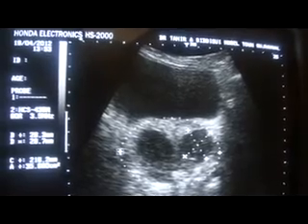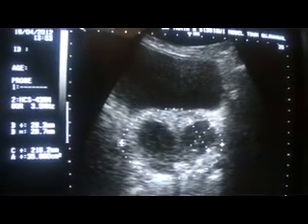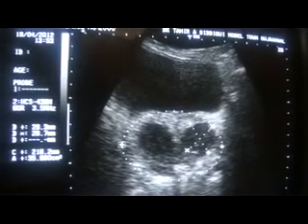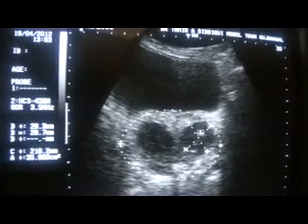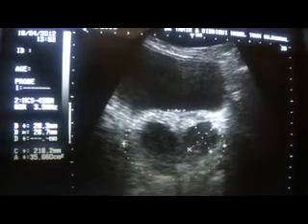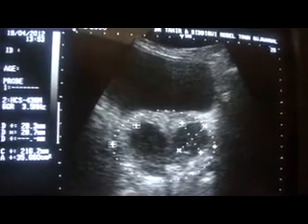These are hypoechoic, totally hypoechoic. This is also hypoechoic, and there is a tiny echogenicity seen at the posterior margin of the left focal lesion. Another point to note is that there is no posterior wall enhancement, no acoustic enhancement seen posterior to these hypoechoic areas.